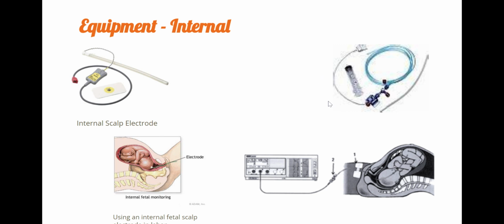Now, over here, we have on the right an internal uterine pressure catheter, also called an IUPC. It hooks into the same monitor that does the external monitoring, but there's this semi-rigid, a little bit flexible lead here, and that can sense the internal pressure of the uterus. So it tells us not just about how frequent or long contractions are, but it tells us more about the actual intensity of those contractions. It measures it in millimeters of mercury. This is also invasive. So again, we don't use it as often. I want you to also notice here on the side of that IUPC is a little port where we can hook up fluids if we need to do an amnio infusion if baby's having trouble with the strip. And I will talk more about that when we talk about variable decelerations.